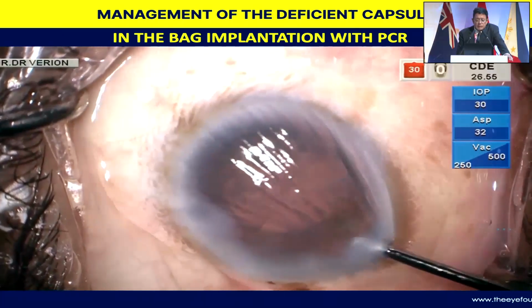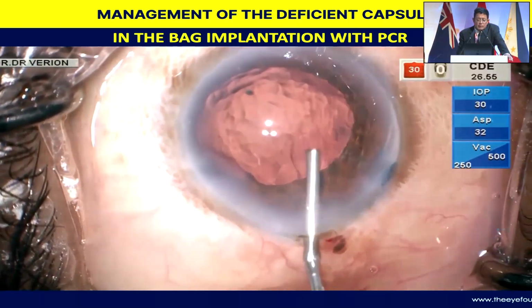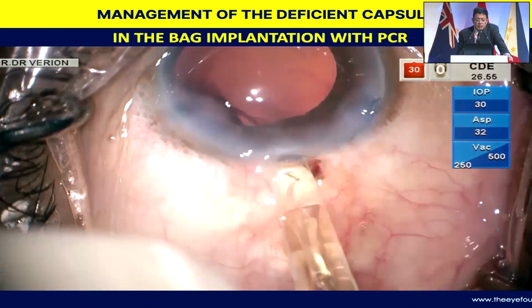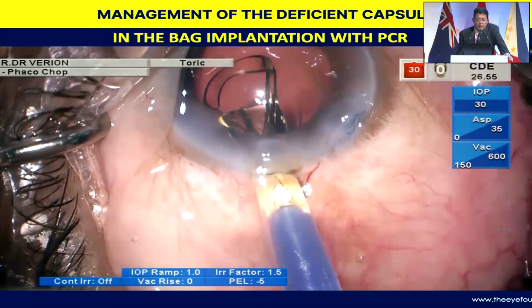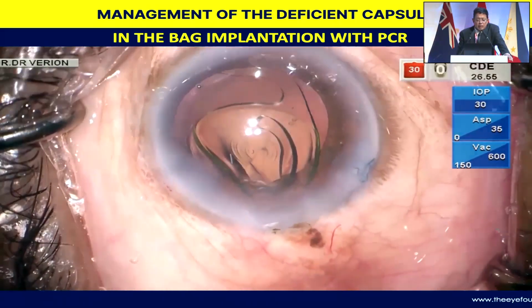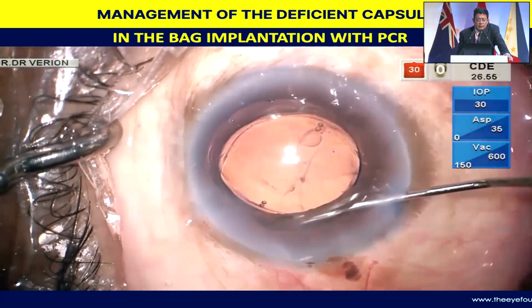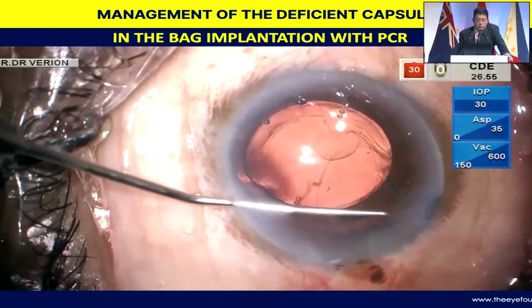And essentially, without the chamber collapsing, I inject dispersive viscoelastic to tamponade the anterior vitreous face. Then subsequently, the vitreous has not yet presented. I inject more of HPMC on top of it. Having inflated the bag quite adequately, this patient was to receive a trifocal toric intraocular lens. The lens of my choice is being injected. The Verion display is on all the time, though it's not being shown on the video. You'll see it towards the end.